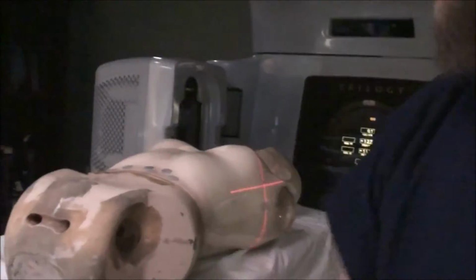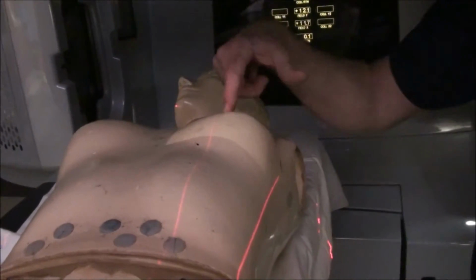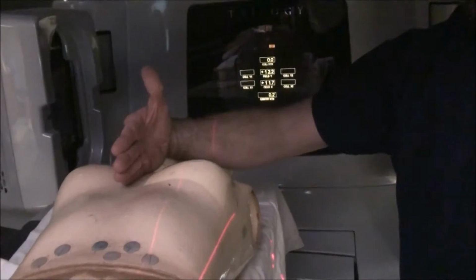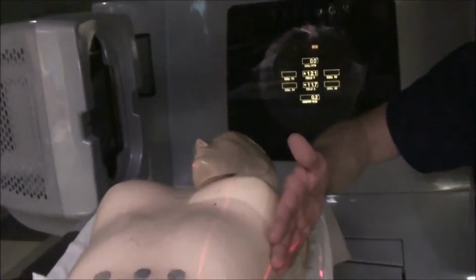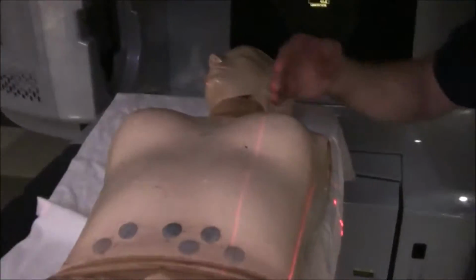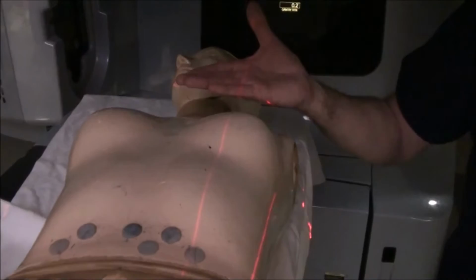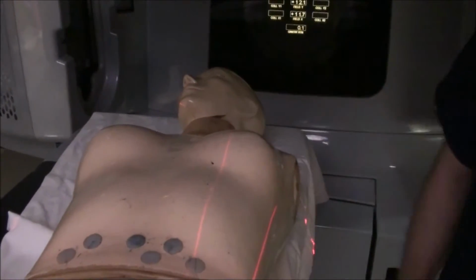such that, hopefully, if your table's not stuck, you're going to move laterally such that the laser and the field, in this particular case, are halfway between the midline and the lateral flash. I'll turn the field light off so you can see the laser right here. That laser bisects the breast. Obviously, not every woman is going to have the same breast as Pixie.